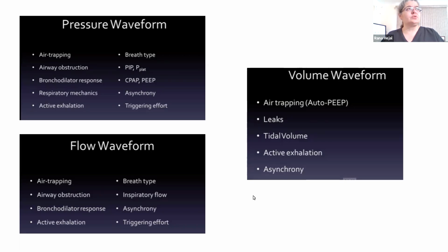And in those patients who you believe are getting too much volume, particularly if you're targeting a low tidal volume strategy like in ARDS, you want to make sure that every breath is the same, because sometimes you will look into breath stacking in it. And I don't mean severe breath stacking, but the milder forms of it that you may be able to tell.